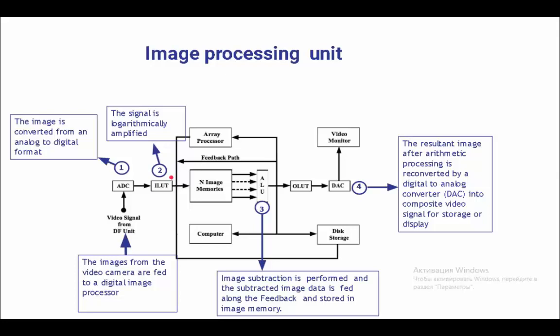So why do we need to logarithmically transform those images? Recall that the image is formed by detection of X-rays that have been attenuated exponentially in the body. And if logarithmic subtraction is not done, the brightness of the object in the subtracted angiographic image, such as vessels with contrast materials, will vary according to the brightness of the underlying tissue in the non-subtracted images.